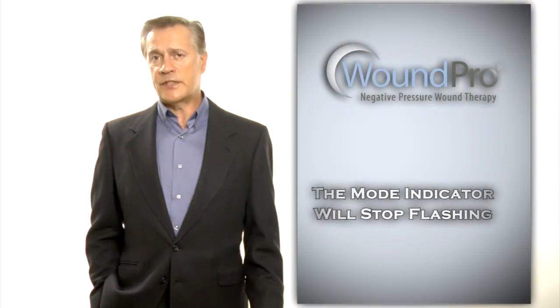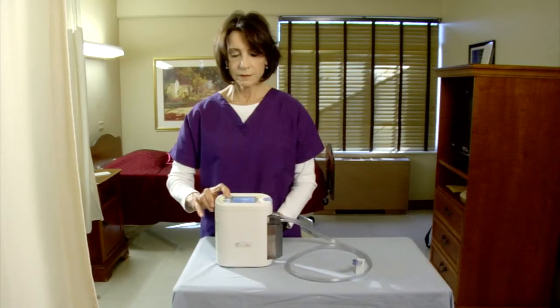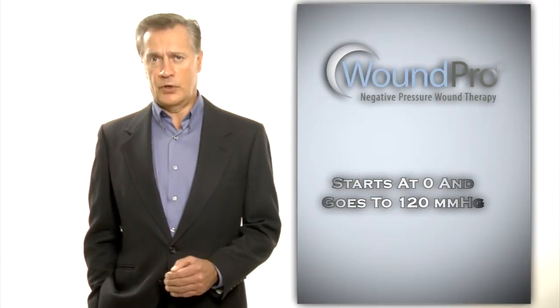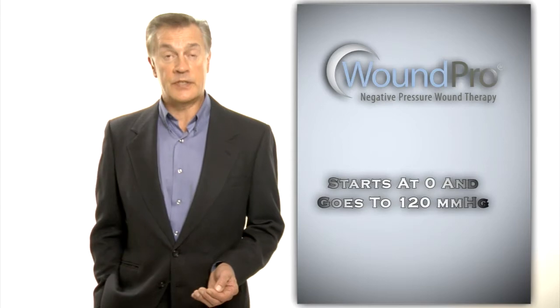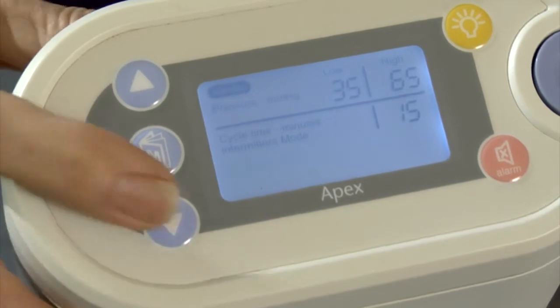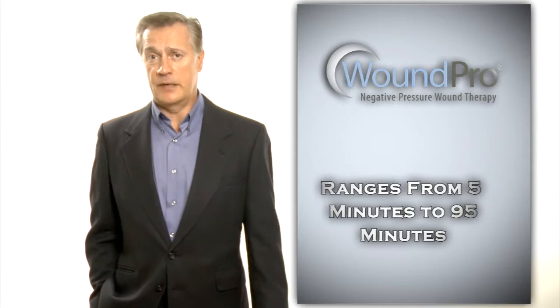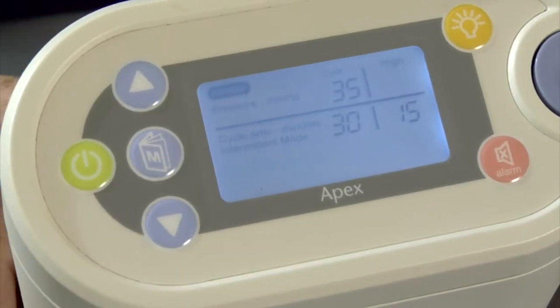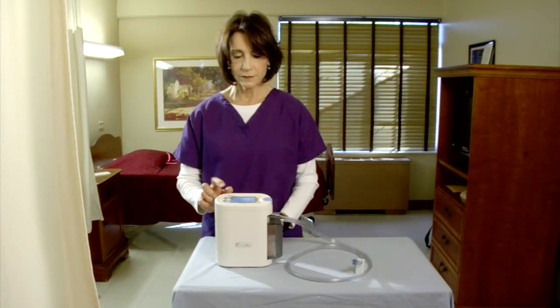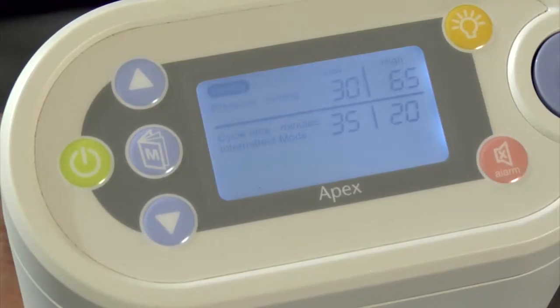The mode indicator will stop flashing and the low pressure setting will begin to flash. Set the desired low pressure. It starts at 0 and goes up to 120 mm mercury. After the desired pressure is selected, press the menu button and you will notice the time interval number will be flashing. Select your desired time, which ranges from 5 minutes up to 95 minutes. After choosing the low settings, you will push the menu button again for the high side of the variable pressure. You will first select your millimeters mercury, press the menu button again, and select the high side time.